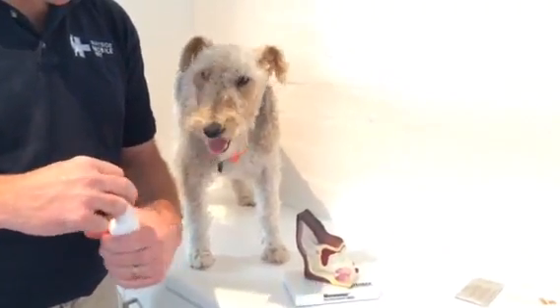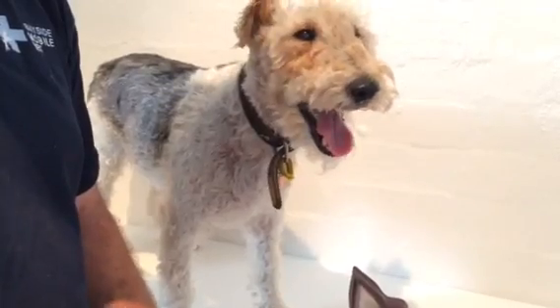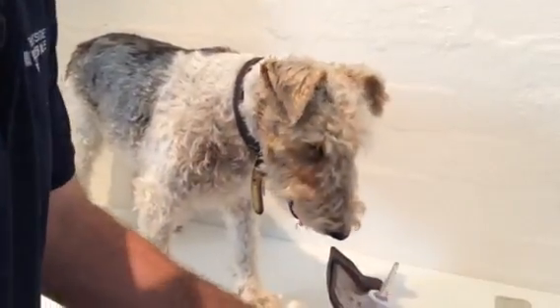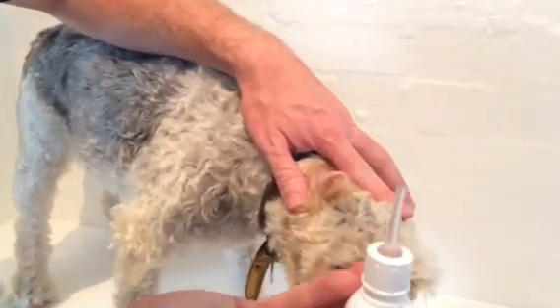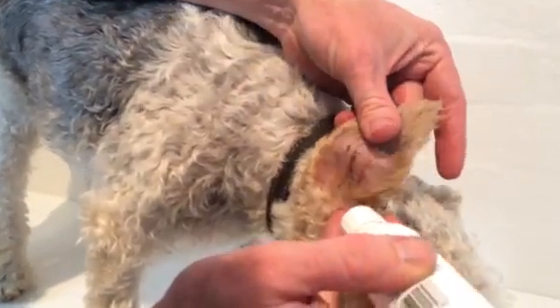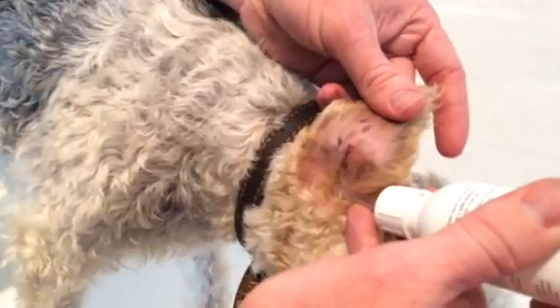We will instill enough of the ear cleaner to fill the ear canal, then loosen up the wax and do the wiping afterwards. The nozzle — and there will be various different types — will go down towards or into the ear canal, and then we squeeze enough liquid to fill up the ear.